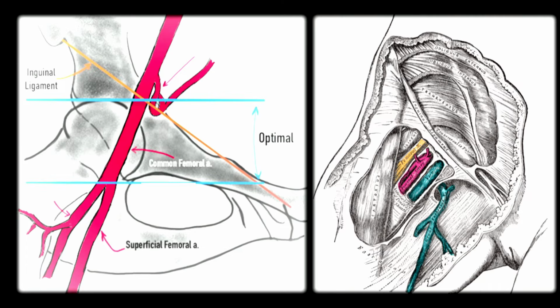And then we talked about access planning. When it comes to access, we want to make sure we study this particular segment of the femoral artery right in front of the femoral head, so that when we are closing, we can apply pressure and we are staying away from this branch. Which branch is this? Anybody? And which vessel is this? Inferior epigastric. So we wanted to make sure we see these two branches and find an optimal angle that opens this up, or know the depth when we have the inferior epigastric artery as well.